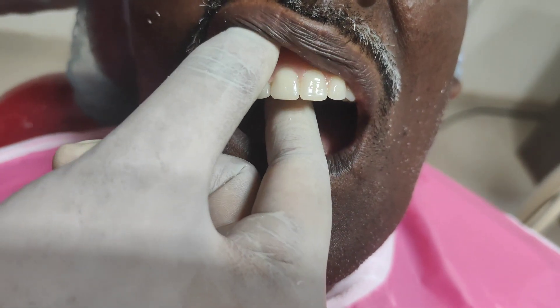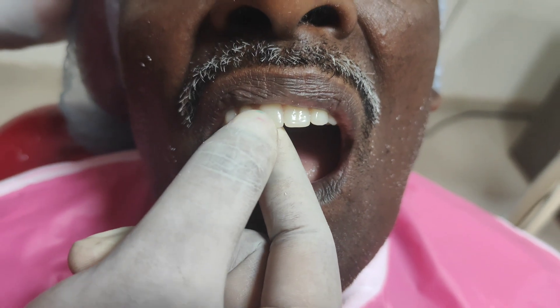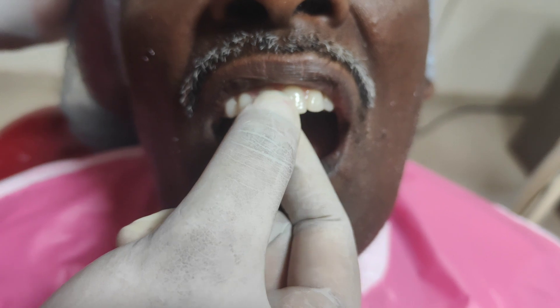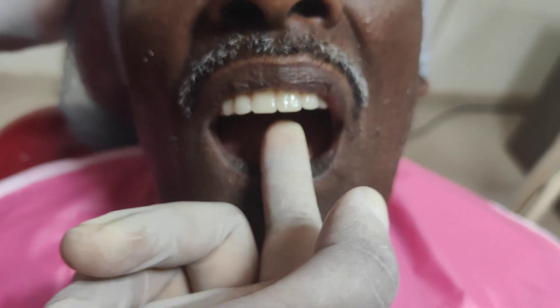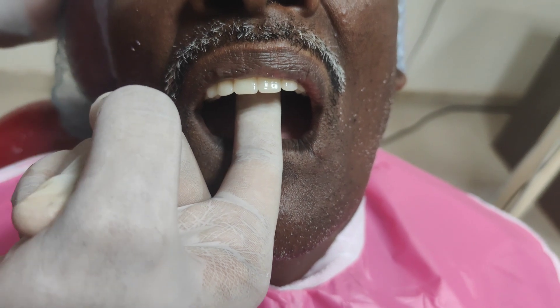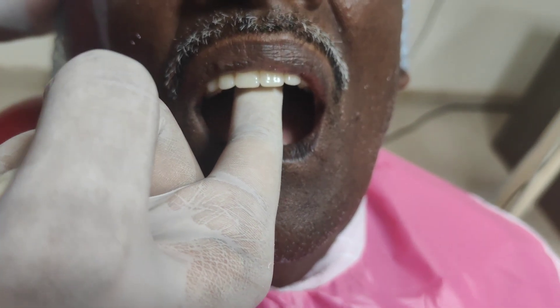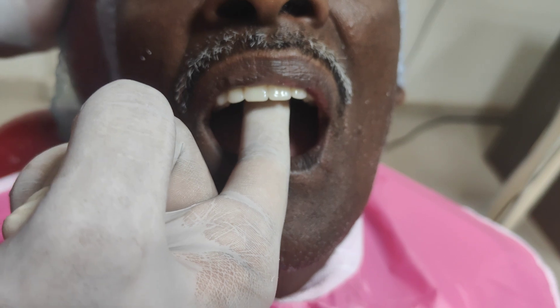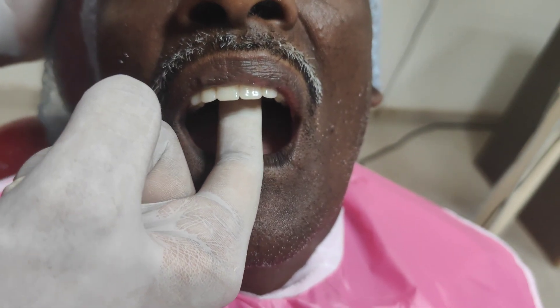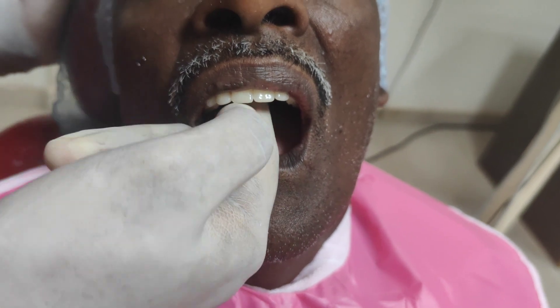Next, the retention and stability of the denture are checked. The denture is inserted into the patient's mouth and two types of seal are checked: the anterior seal and the posterior seal. The anterior seal is checked by pulling the denture vertically out against the path of insertion, and the posterior seal is checked by placing the finger on the palatal surface — the denture should not lift on the posterior surface.